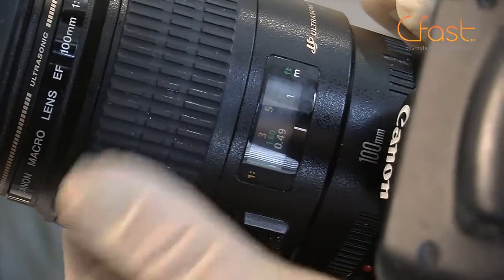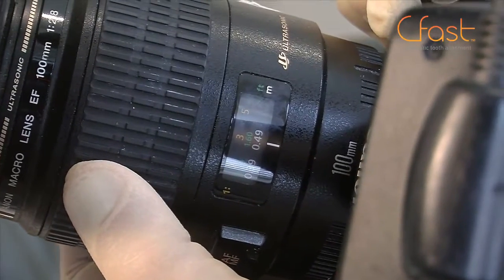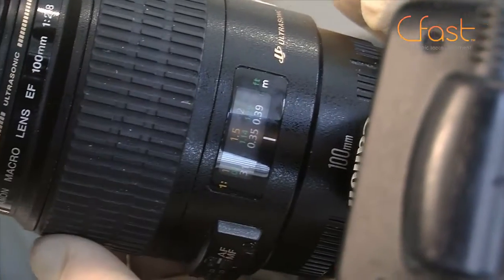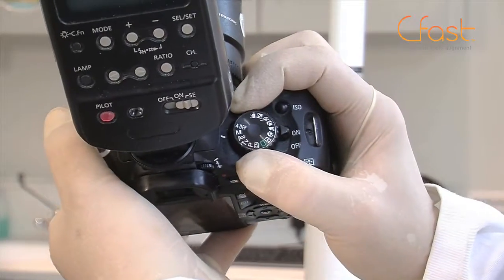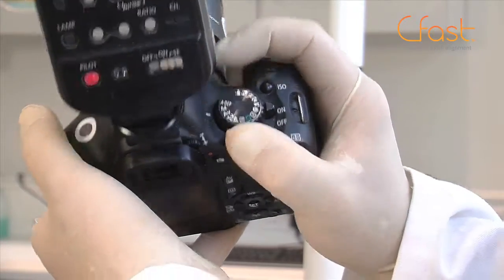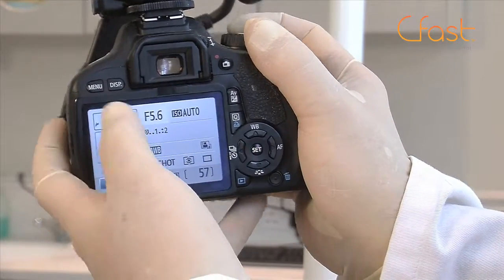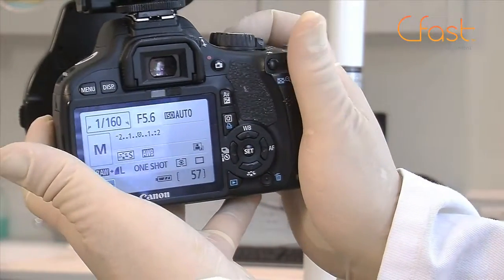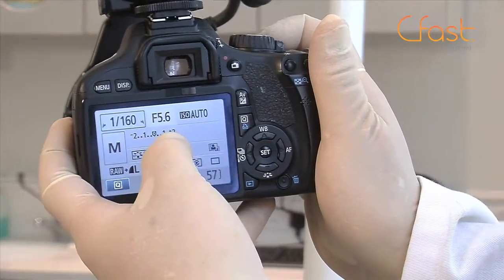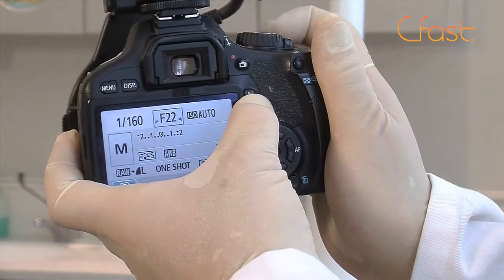So it only needs to be changed. That's the portrait. That's all the 1 to 2 shots, including the occlusal. And this will be our close-up 1 to 1. So this being a Canon, we're going to shoot it on M for manual. But the only thing we're going to change is our aperture, this being our shutter speed. Now, if we change the dial here, it will change the shutter speed. We don't need to change that. So to change our aperture here, we press AV and wind it up to f/25.